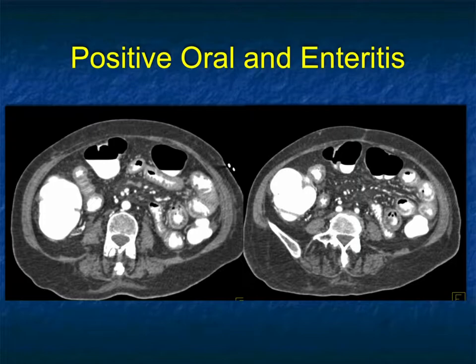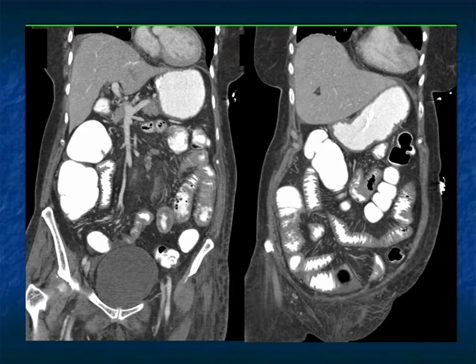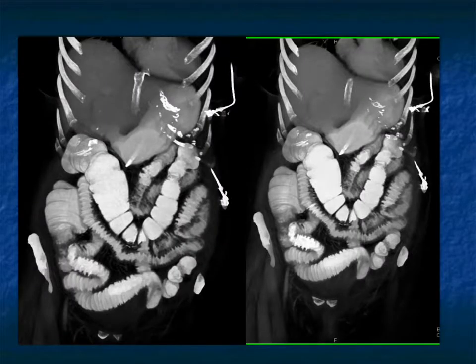One of the things I have done a bit of, but think we need to do more, is cinematic rendering in patients with positive oral contrast. I'll show you some examples and leave you with this to think about. This is a nice case — there are some dilated thickened small bowel loops. You can see fold thickening nicely on the coronal views and on the patient's volume rendered imaging.